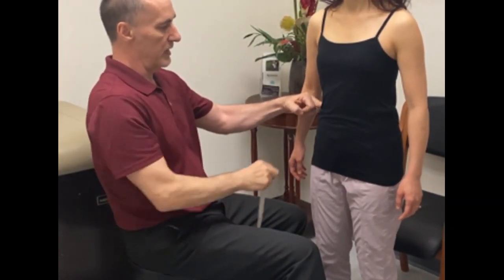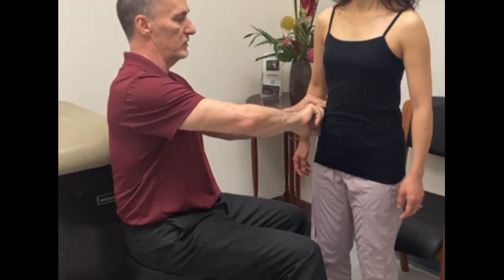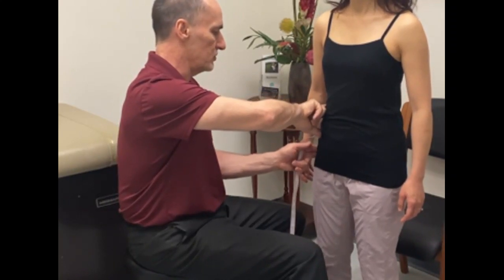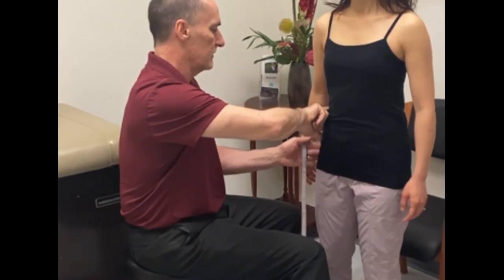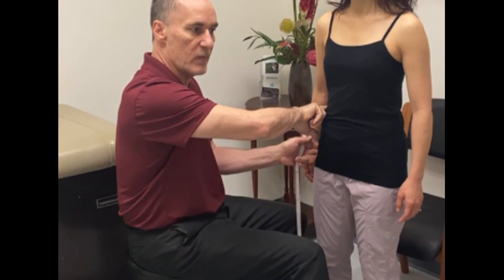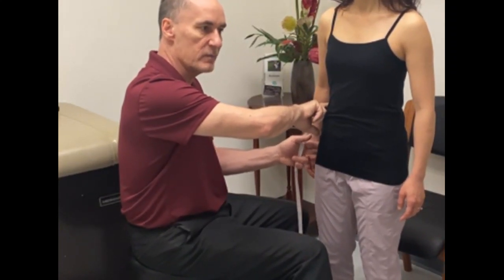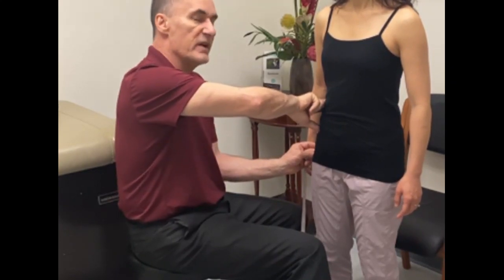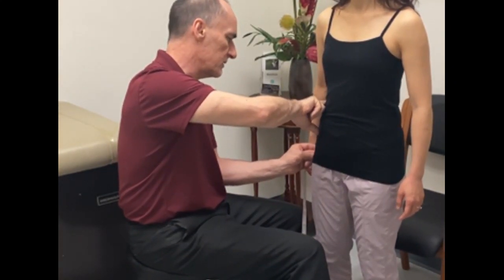Keep your finger at the waist point, then place the tape measure at that point and measure from the waist down to the greater trochanter. It's not always easy to get that measurement — you have to really prod in there to make sure you get the greater trochanter, measuring to the inferior aspect of the greater trochanter.